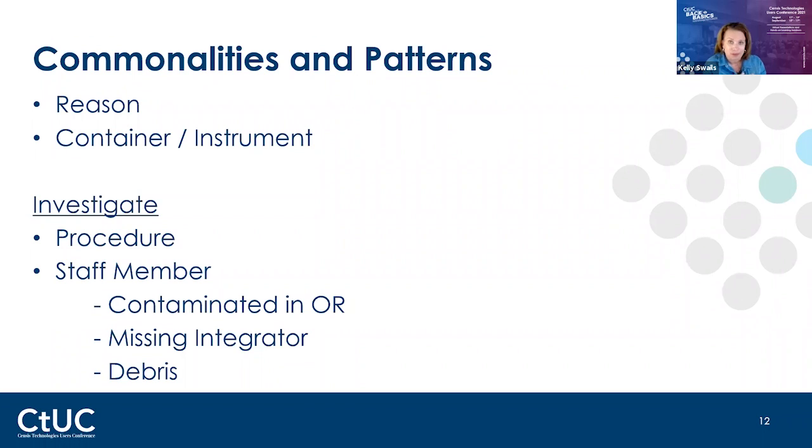Look at the staff member. So remember I said, you don't want to be shaming. You don't want to ever have someone be afraid to say they contaminated. And so then with that, you still want to look at that though. So if you see it many times, and you may not even know that, but if you're seeing contaminated in the OR and you're seeing that trend, I would take that and those cases, and when that was done, and bring it to OR leadership. They can then look and see, okay, who is the tech in the room?